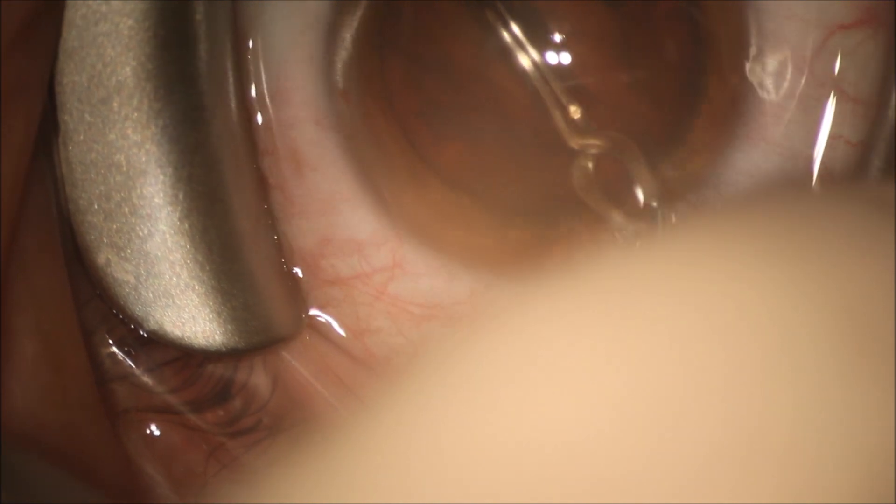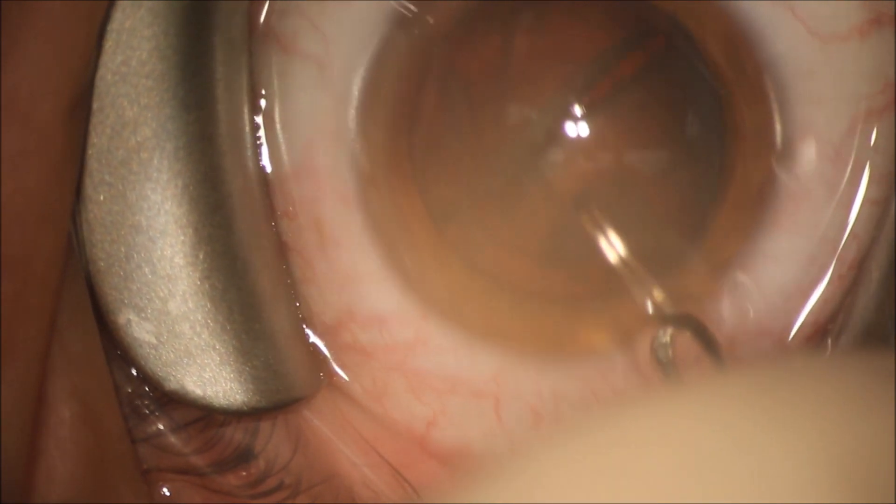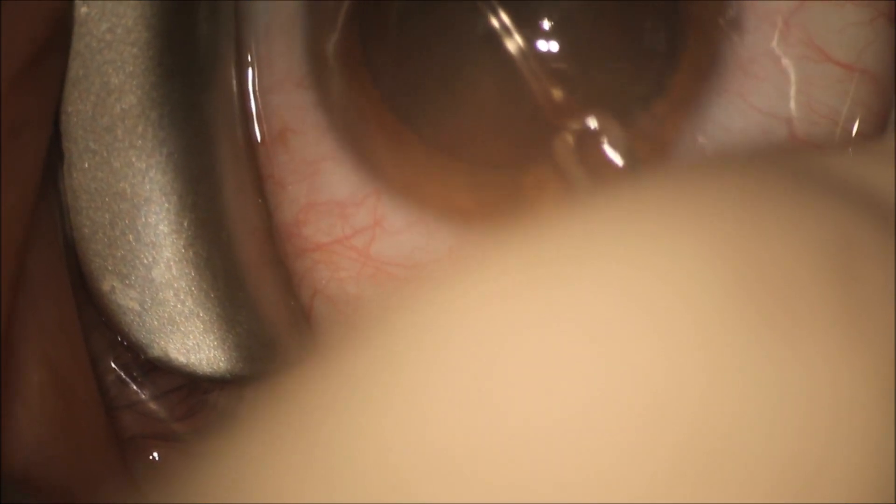We easily were able to spin the cataract inside the capsular bag. We're now using an Akihoshi pre-chopper to break the cataract up into four pieces, and we do this quite easily.